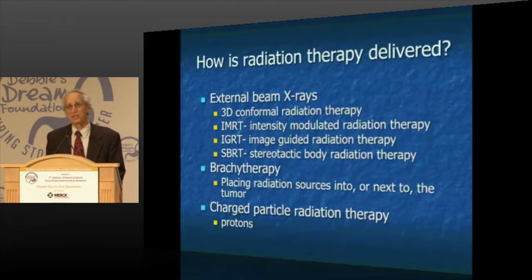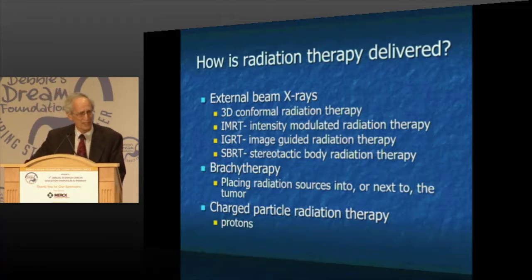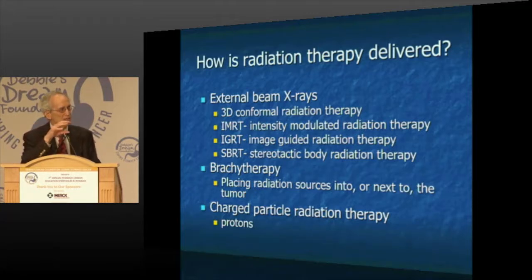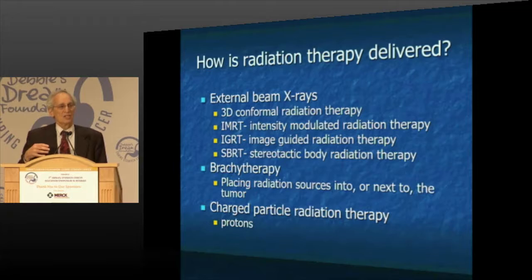So, a little more about how radiation therapy is delivered, and there are a lot of different words that I will explain a little bit to you as we go on. And you may hear these if you see your physician. We're going to use 3D conformal radiation therapy, or intensity modulated radiation therapy, or image-guided radiation therapy, or stereotactic body radiation therapy, or brachytherapy. And these are really technical issues trying to accomplish what radiation oncologists spend a lot of time doing, which is directing the radiation dose as much as possible only to the area where we want it. If you treat areas where you don't need to treat, you only get problems. You only get symptoms from the treatment, and you don't get benefit. So it's really important that we define what it is we need to treat and then try to limit the radiation beam to accomplish that.